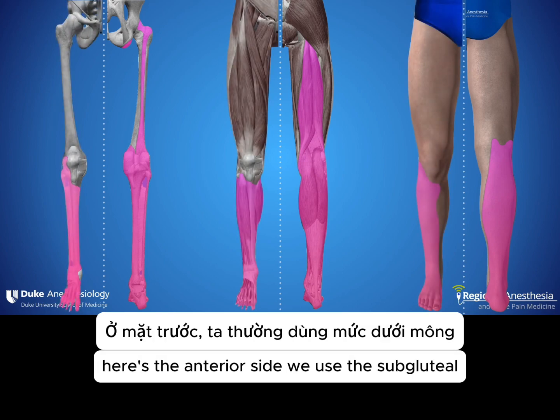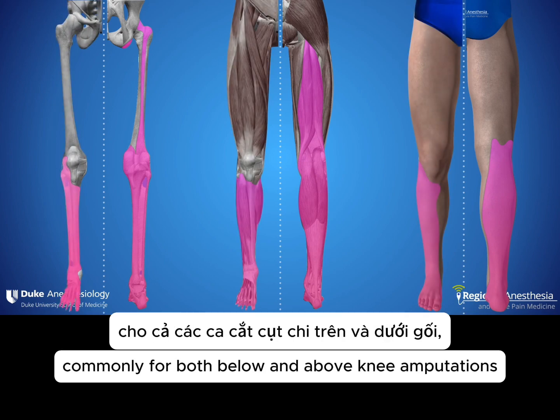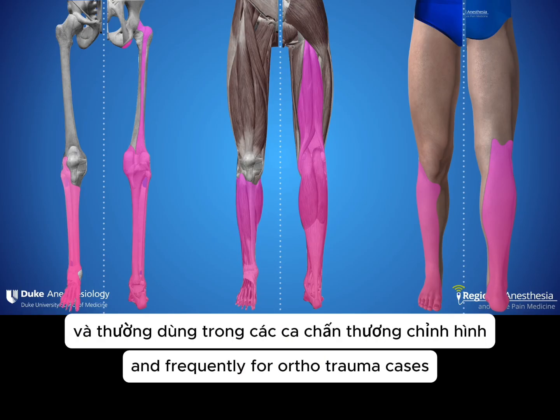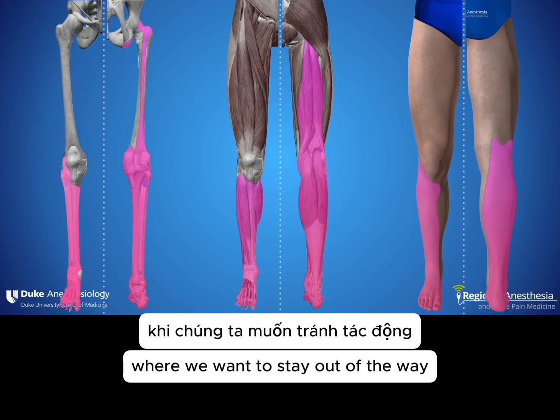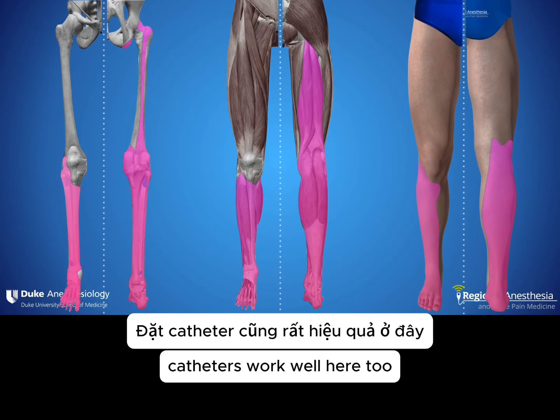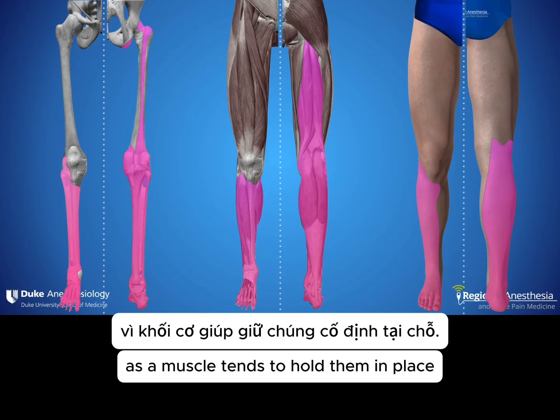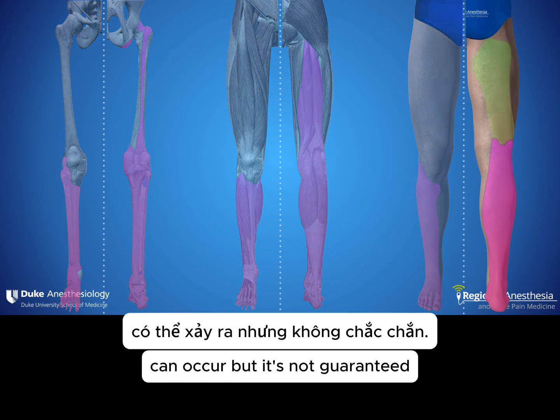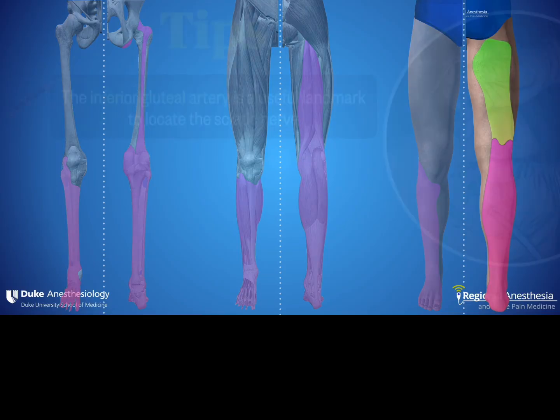We use the subgluteal commonly for both below and above knee amputations, in combination with a femoral block for ACL repair, and frequently for orthotrauma cases where we want to stay out of the way of the surgical site near the proximal tibia. Catheters work well here too, as the muscle tends to hold them in place. Note that a block of the posterior cutaneous nerve of the thigh can occur, but it's not guaranteed.